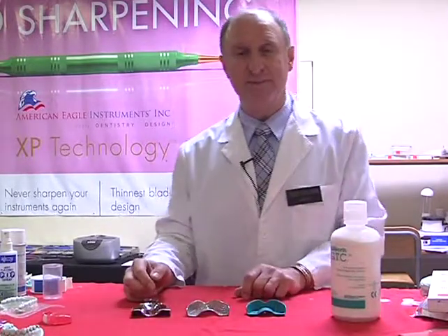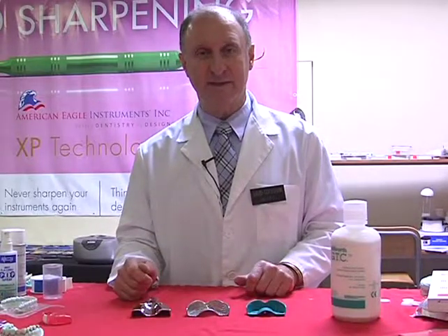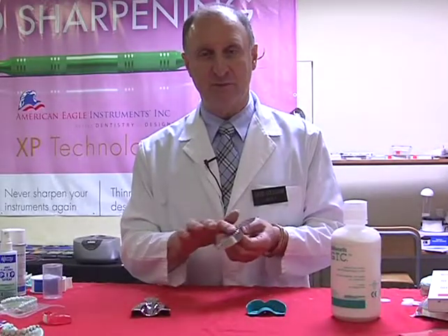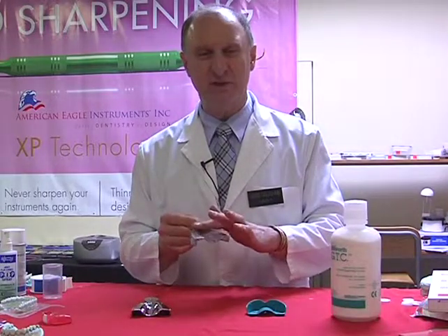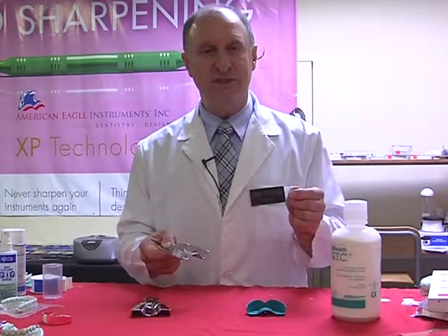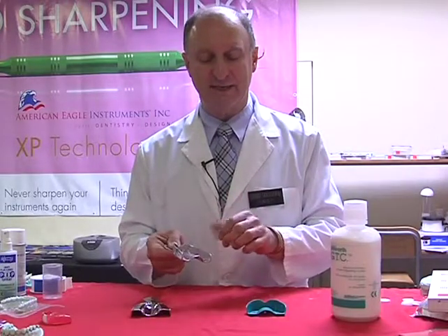So what we should normally be doing once we've removed our models, separated them, and are ready to clean out the impression tray, is break off all the material from the external portion of the tray. That means literally with a finger or a knife, but usually a finger's better. Just literally pull off all the little nodules of the alginate away from the tray, and then it's much easier to pull out the impression material that's caught inside here.